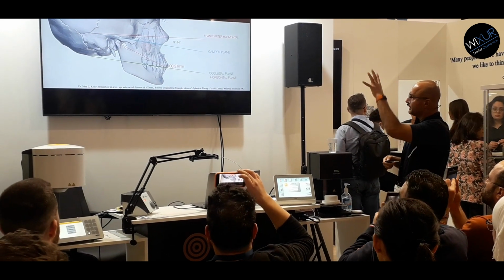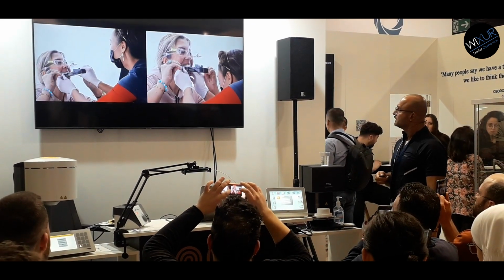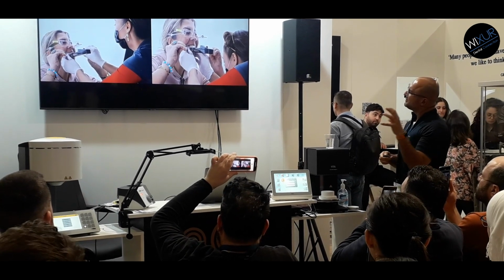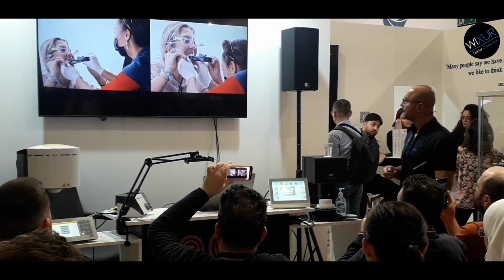So that is all the information which we need. So here is Dr. Bernard busy defining the position of the upper jaw related to the eyes.